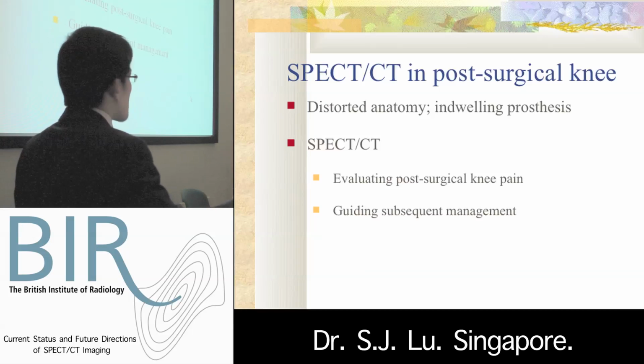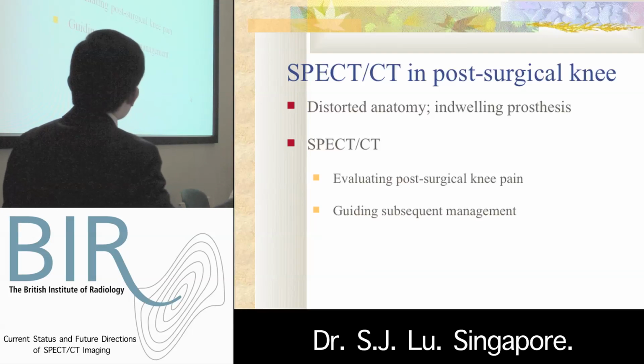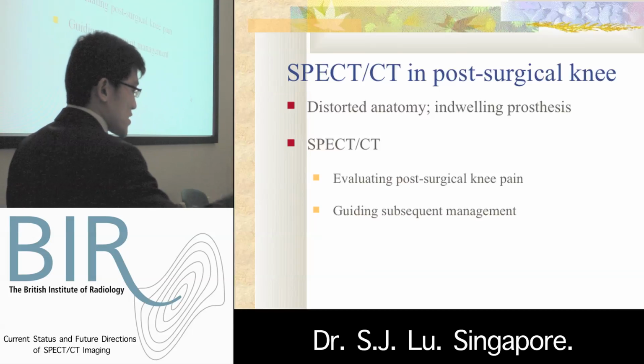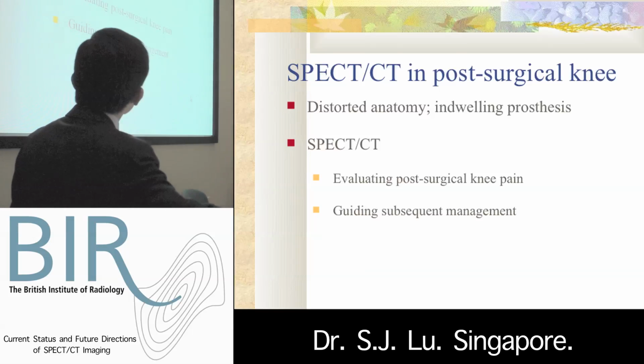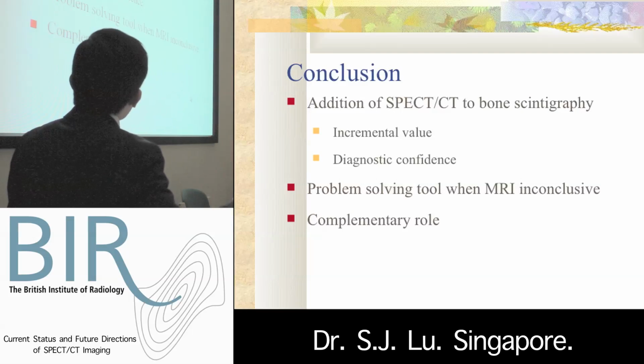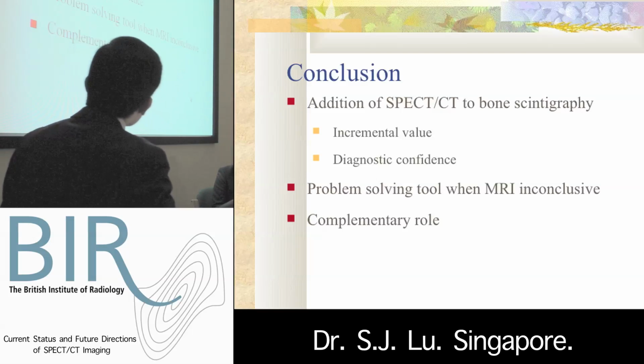Imaging of the post-surgical knee is often challenging because of the distorted anatomy and also the indwelling prostheses. And this will be further covered in the next talk. So in conclusion, when performing a bone scan for knee pain, addition of SPECT-CT should be considered because of the incremental value that it adds, as well as the improved diagnostic confidence.